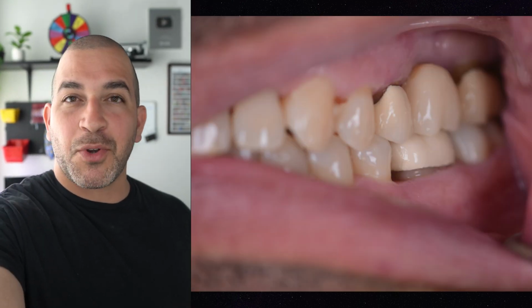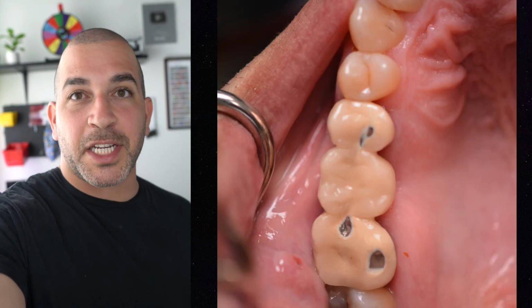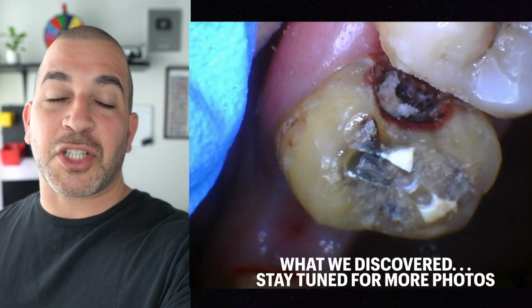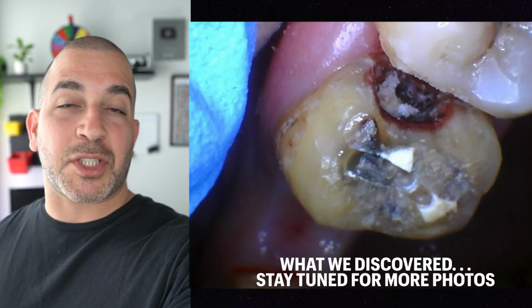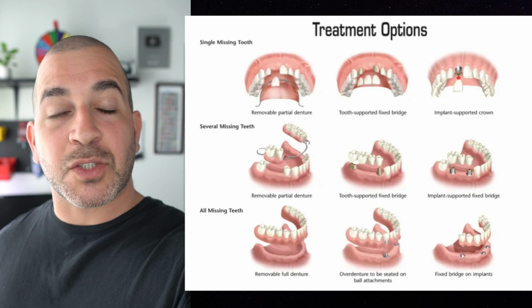Now, for those of you that don't know, if you have a bridge and you have a large cavity under the bridge on one of the supporting teeth that we call abutments, we have to remove that bridge, explore how large the cavity is, and unfortunately, there are a lot of unknowns. If we take this bridge off and we see a large cavity that is essentially around the entire tooth and the tooth is not restorable, we may have to eventually take that tooth out.